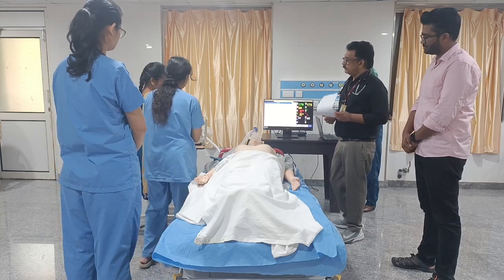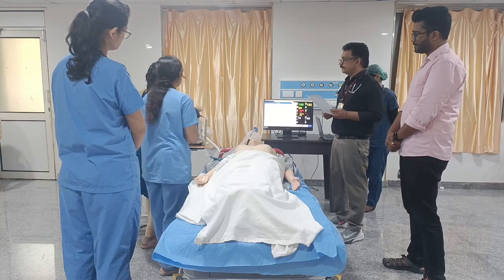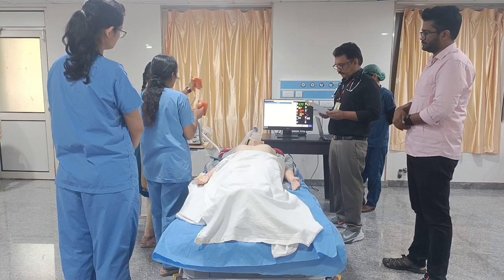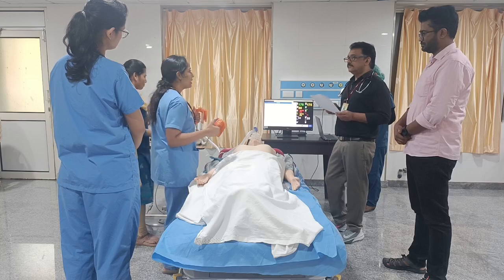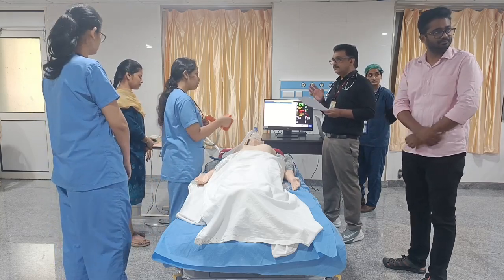And then we'll be charging the defibrillator to 120 joules. Initially 120 joules can be given, as synchronized cardioversion. And then we'll have to charge the paddles, and we'll be placing the paddles in anterior lateral. That is, the anterior paddle will be kept just below the clavicle, right of the sternum.